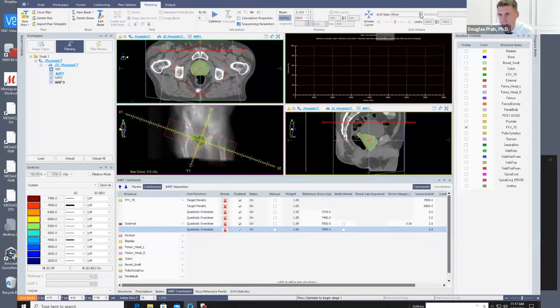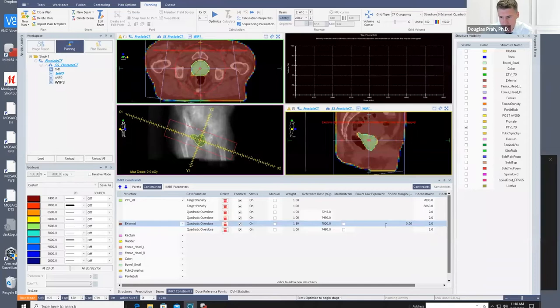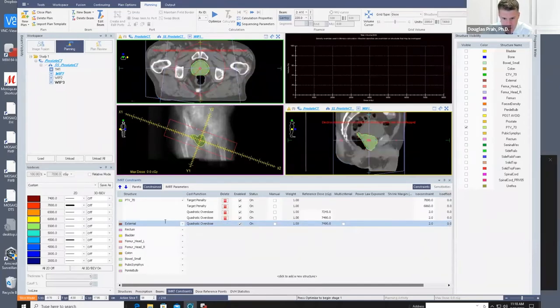I just want you to see, I use this tool quite often, and this is cost function occupancy. I strongly encourage everybody to have this on while they're setting up their constraints. It allows you to see, as you create your constraints, how they're impacting the plan. Right now, all of this red area is 100% impacted. You can see this one here has a shrink margin on it. I'm just going to delete that one and then we'll create a new one.